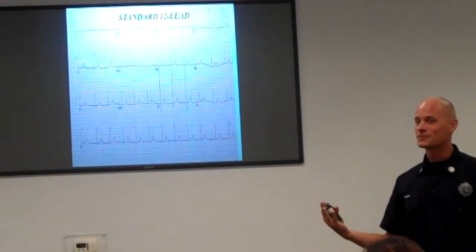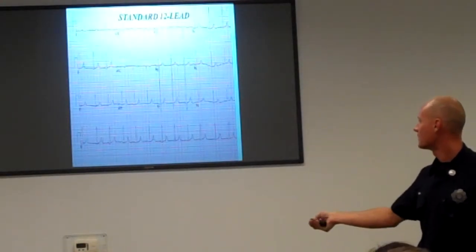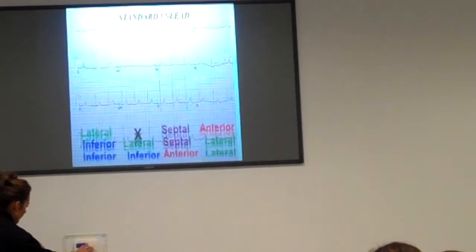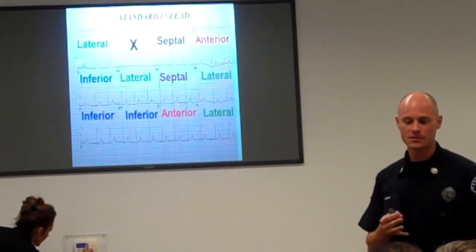Okay. Standard 12 lead. This is what you guys have. Nice, beautiful, clean. They even put down here lead 2, which we're not going to have. Okay. This is what you guys should have on your little cards here.